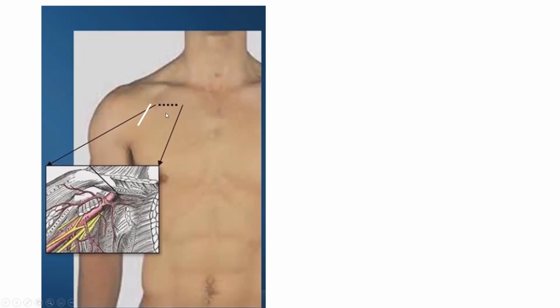So it's the anterior chest. In patients with ICD, we may end up having to stick more laterally, and we risk hitting the A3 segment and the brachial plexus. But we definitely try, even in ICD patients, to stay on the inside of that deltopectoral groove.